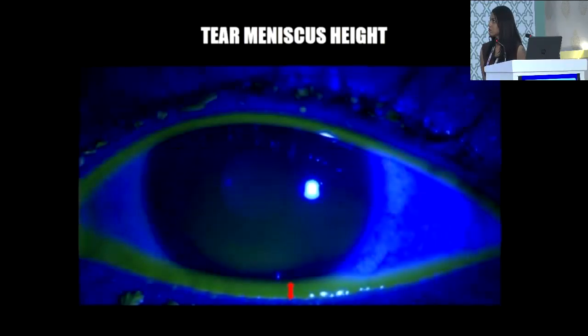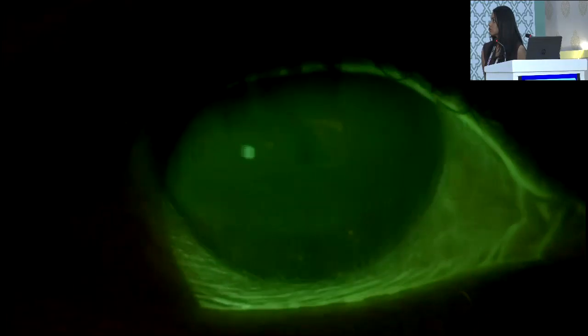Dry eye evaluation involves both functional and structural assessment of the tear film and the ocular surface. Fluorescein dye helps visualize the tear meniscus along the lower lid margin. It's a crude method to assess the volume of aqueous in the tear film. In a normal eye, it's around 0.2 to 0.4 millimeter, while in a dry eye, it's less than 0.25 millimeter.